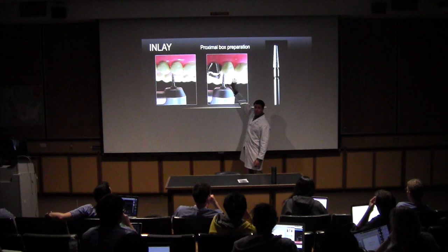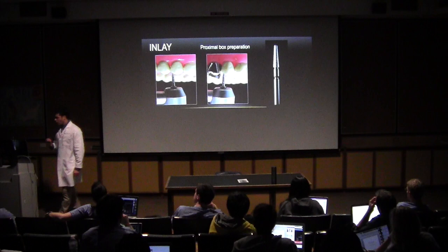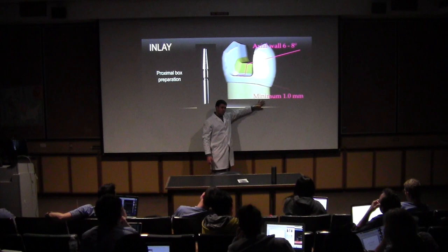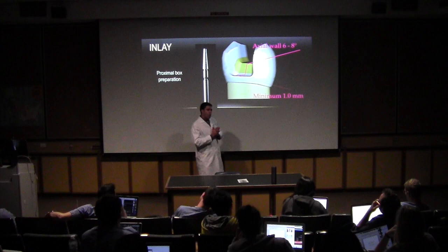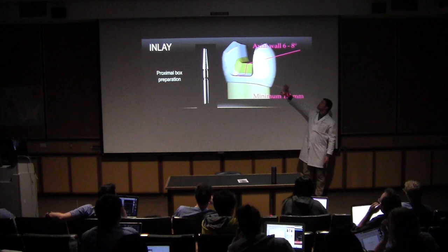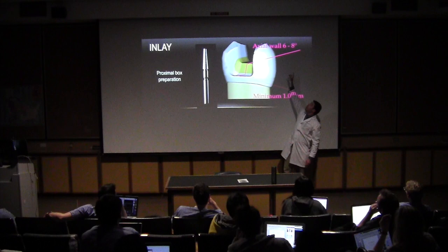The ideal size of the proximal box: we will have the gingival wall with a minimum of 1 millimeter, all right? And we must have convergence between the axial walls, okay? And this we are going to achieve through the inclination of the active tip of the diamond point too, all right? See here, the axial wall, 6 to 8 degrees, is the convergence of the axial wall.